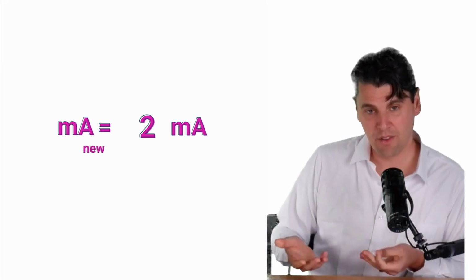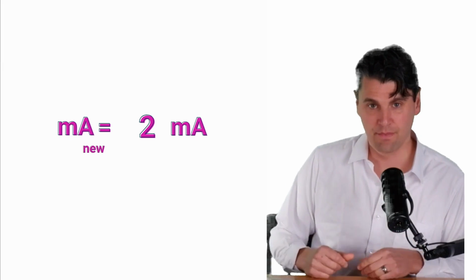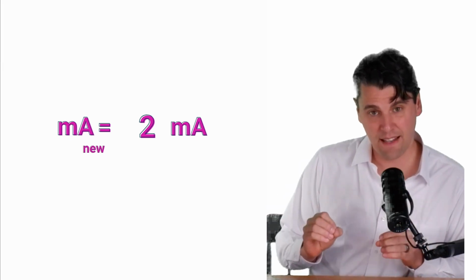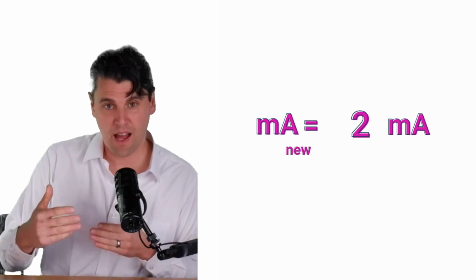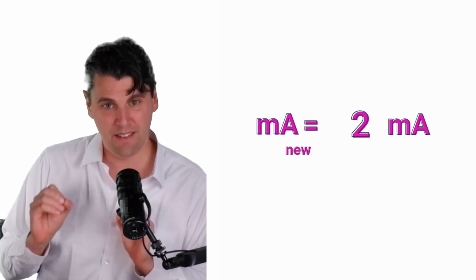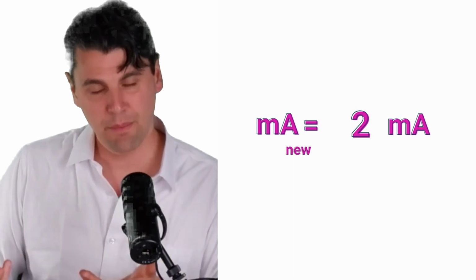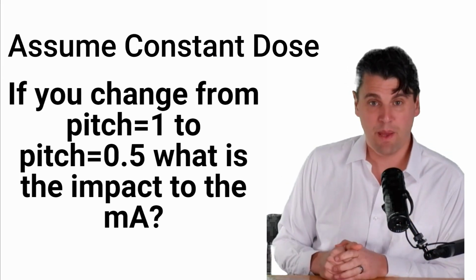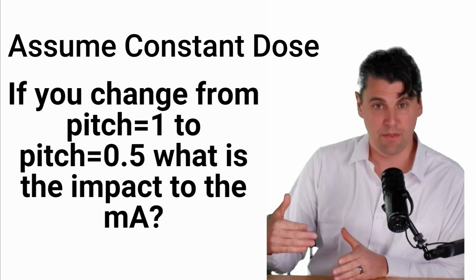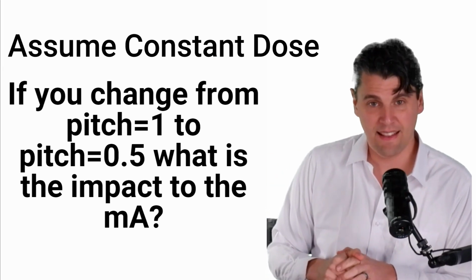The MA is going to specify how many x-rays. The MA is linearly related to how many x-rays we can get in a unit of time. So if you have half as much time, you need twice as many x-rays in a unit of time in order to keep the dose the same. If we want to keep the dose the same, if you change the pitch from a pitch of 1 to a pitch of 1/2, what's the effect on the MA?